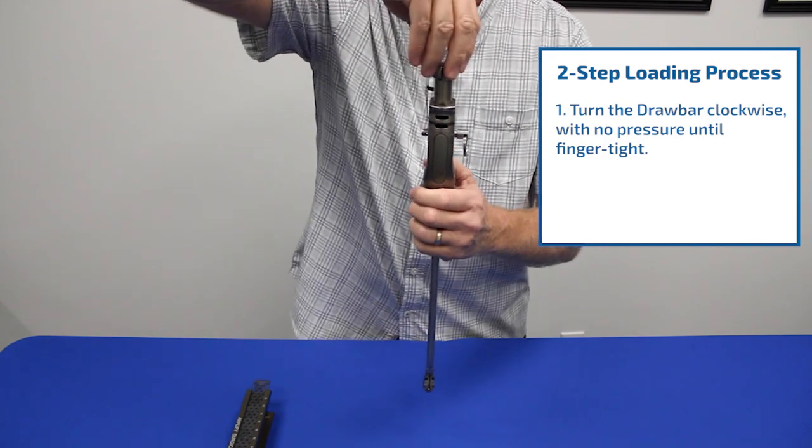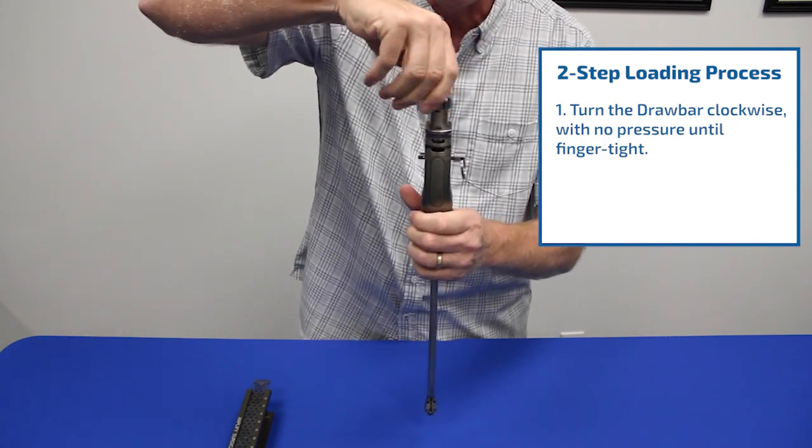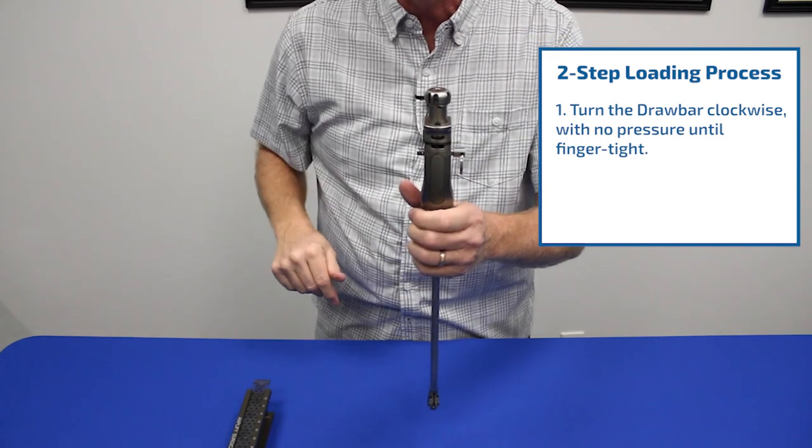The second step is to plunge the draw bar down and turn until it's tight. Again, snug, not tight.